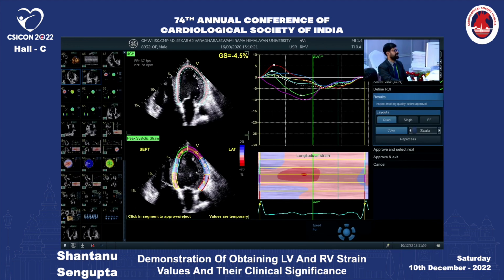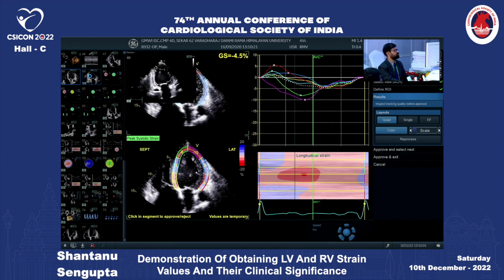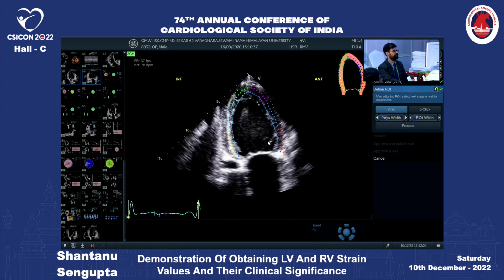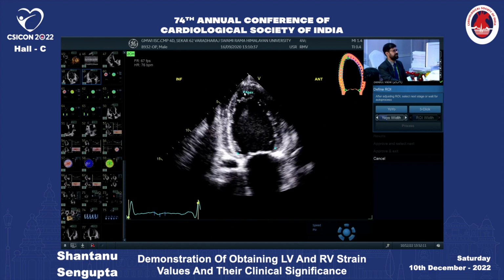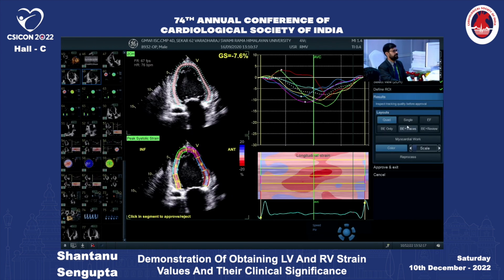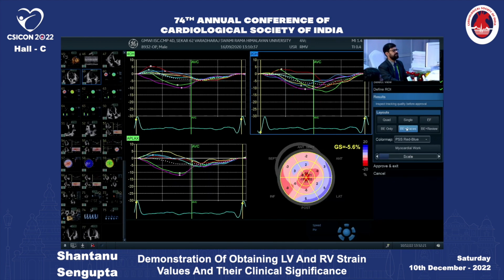There is a lot of dyskinesia, and I will go to the 2 chamber view and do the same thing. The machine also does it automatically, but just for the sake of it, I will process this fast. Okay, and we have good information. So now, this is a very important picture.